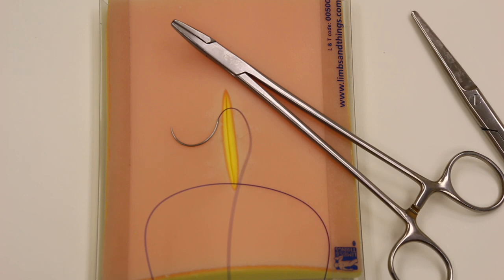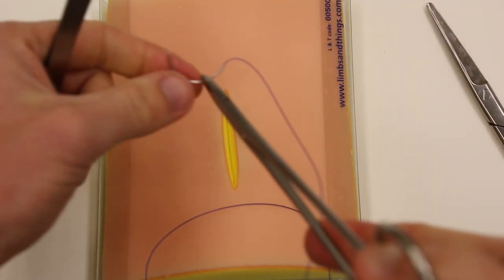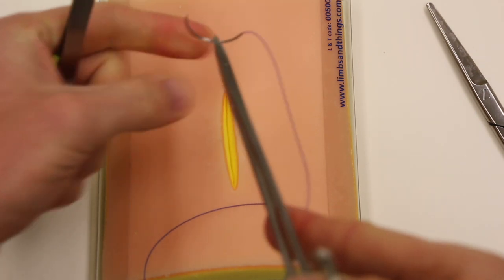The next technique we'll talk about here is the vertical and the horizontal mattress. These are both typically done with larger needles like a CT1 needle here and a heavy monofilament. This is oproline shown here.